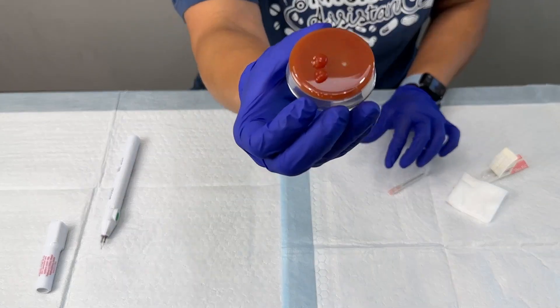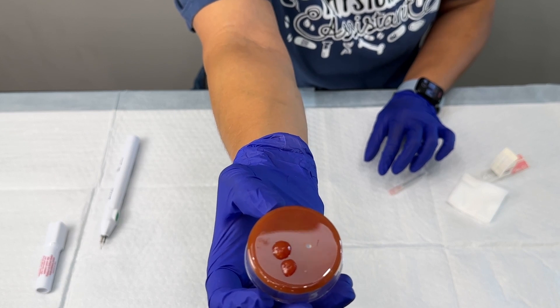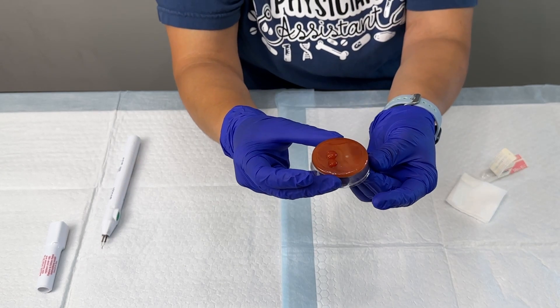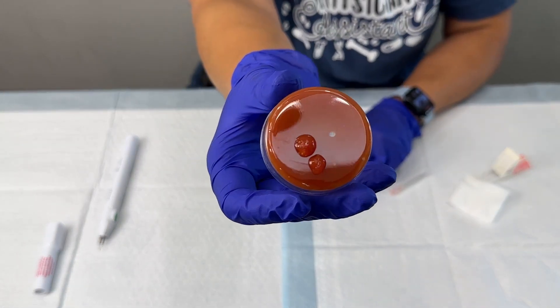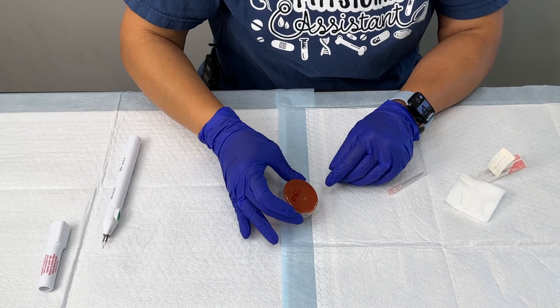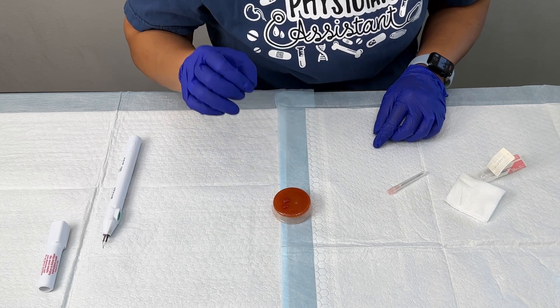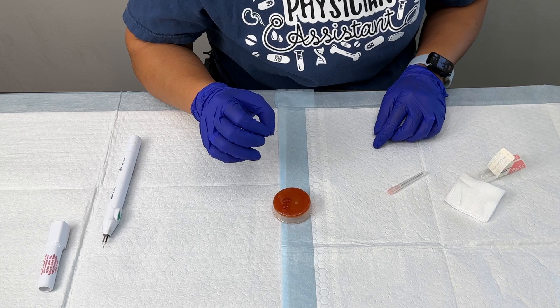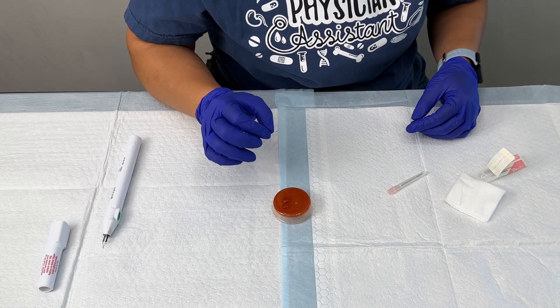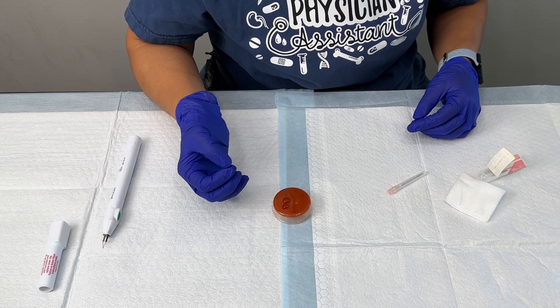Here are the two nail trepanations that I did — one with the 18 gauge and one with the cautery pen. With these practice models, you can practice several times getting the effect you desire to get that blood out from under the nail. That's it for this procedure, it's really simple. A nice demo and replication of a nail trepanation so you can practice at home. Of course it's not exactly like the real thing, but once you've practiced this a few times and worked on your technique, when you get in to do a real one with your patient, you'll be a lot more confident.